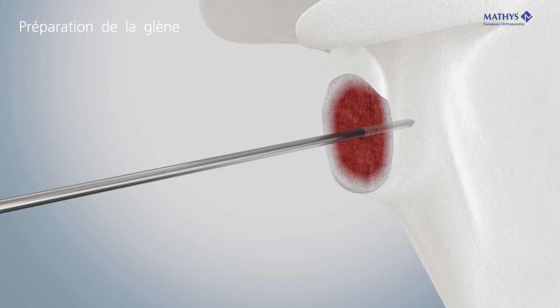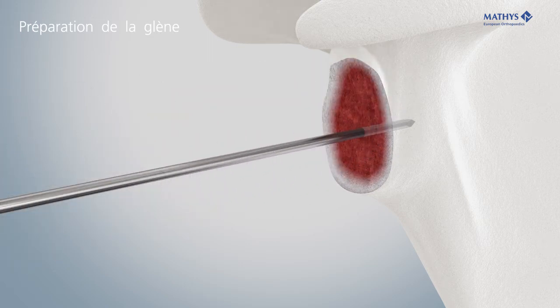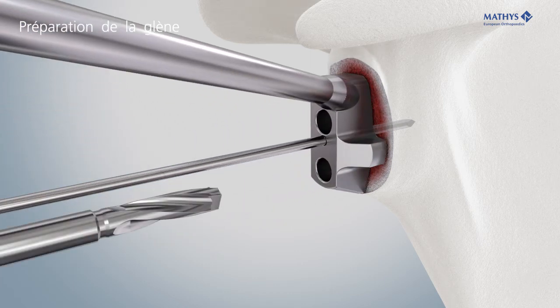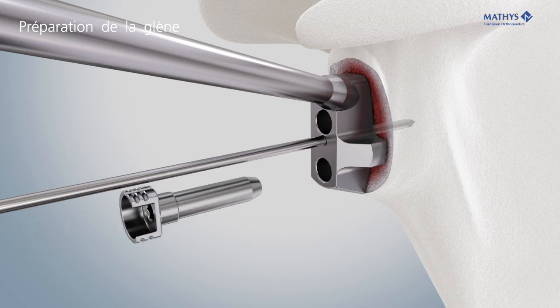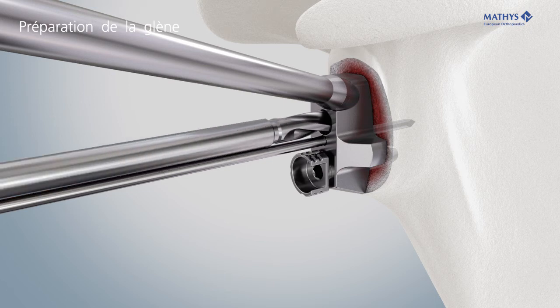The glenoid reamer 42 is used to remove osseous protrusions that could otherwise prevent a snap-in of the glenosphere. To prepare the holes for the pegs, slide the metaglene drill guide over the Kirschner wire. Use the metaglene drill. Insert the fixation pin to prevent rotation of the guide. Drill the second anchoring hole.